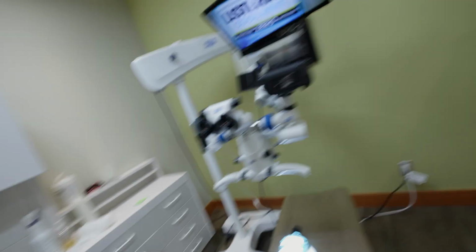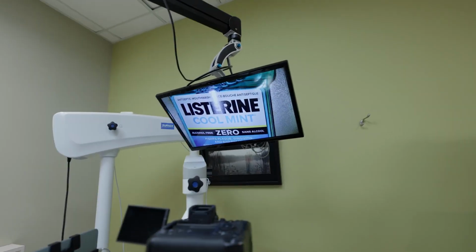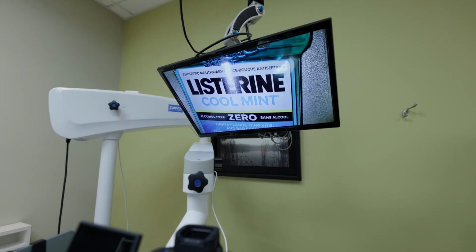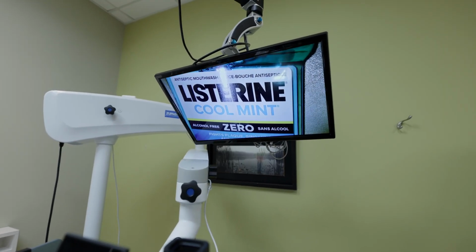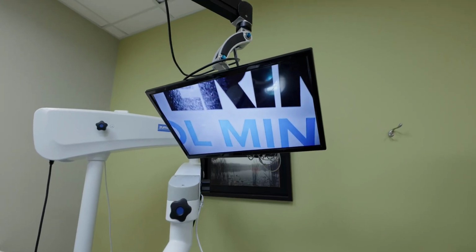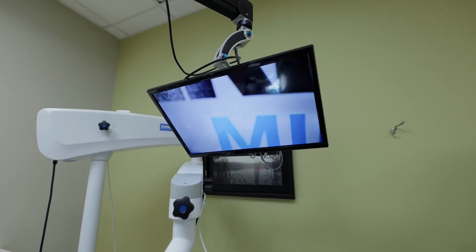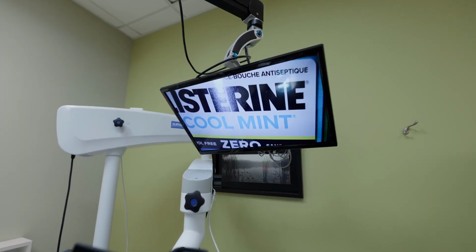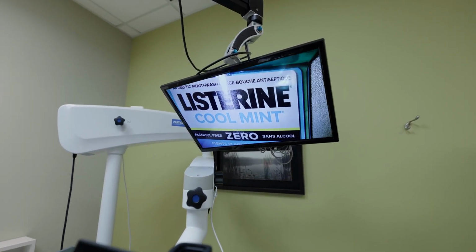The other cool thing, and you'll be able to see if I just keep this focused on the screen, the microscope has a continuous zoom. So instead of a step zoom, you've got continuous. And as you can see, it's parfocal all the way through the zoom range. They say it's from 2 to 20. I think it's more like 4 to 20, to be fair.